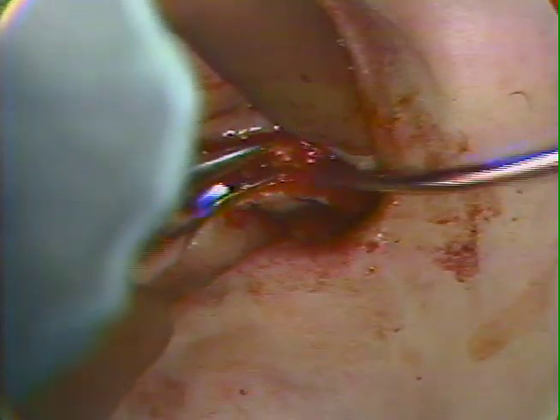So now I will trim this by grasping some of that tissue, and the assistant will clear the beaks of the forceps before we go back, as well as keeping the field clean by suctioning. Now we have completed some of the soft tissue trimming and bone modification here, and are just about ready to close. Now, as we have established some reasonable hemostasis, we have been into this area and irrigated things out well.